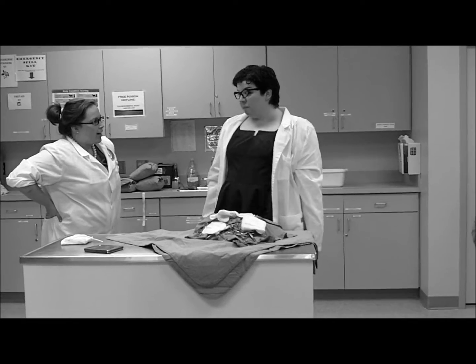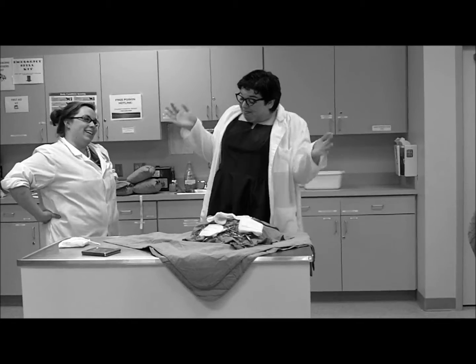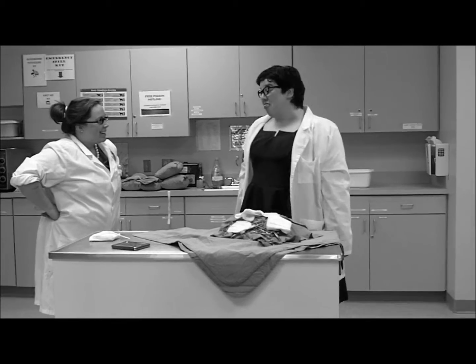Emily, what are you doing? I'm wrapping a pack. Well, that's not how it's done. Let me show you the proper way to wrap that pack. Gee, Randy, that'd be swell.